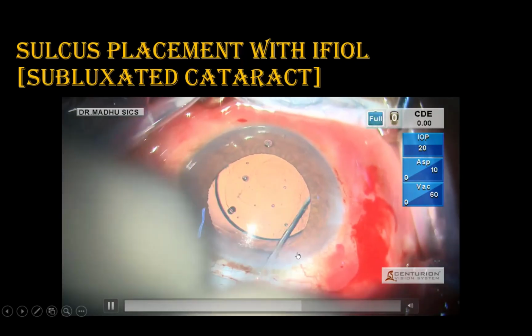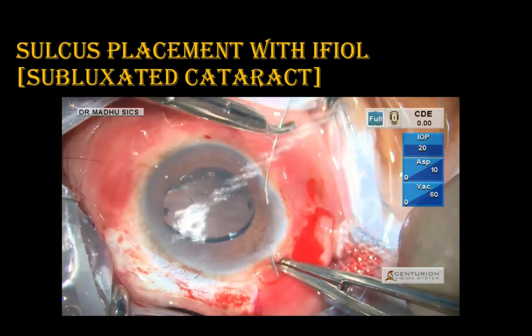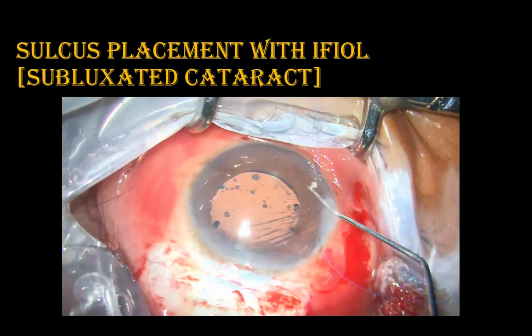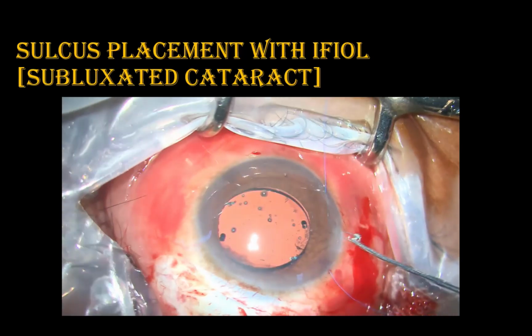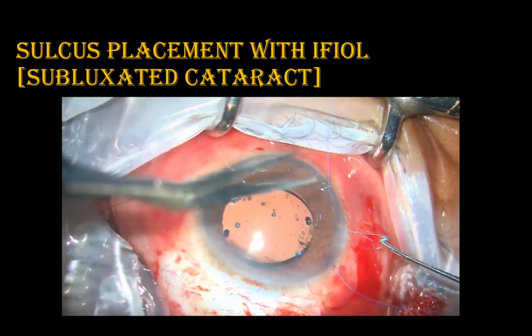So in this case, IOL was placed in the sulcus, but I was not sure about support on that other side where there was a large dialysis. So I fixated that part to the iris with the iris fixation technique.